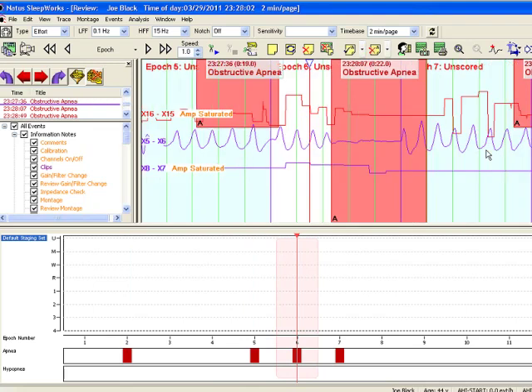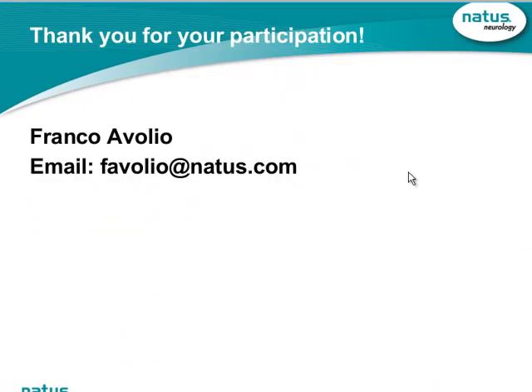Okay. I just got another question, so I'm going to take an opportunity to answer it. If you set analyzers on one acquisition computer, will the settings cross over to the other computers? Very good question. When you set your analyzer settings, they do not carry over to other machines. There are settings like montages that do carry over, but unfortunately, when it comes to analyzer settings, they do not.